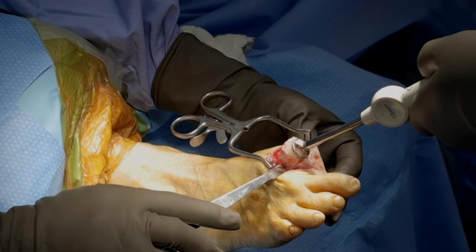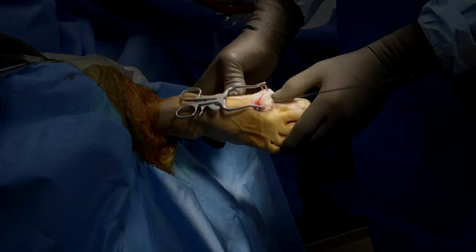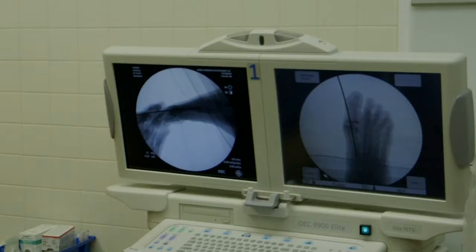You'll see Lori's adjusting me because she's watching from that direction. On a side view I can see that it looks like I'm going down the length of the metatarsal — I might be a little dorsiflexed and we'll check an x-ray. When we bring in the x-ray, especially when you first start doing these, it's a good idea to check x-ray and make sure you're happy with where your wire is sitting in the metatarsal. You can see on that view I'm straight down the metatarsal shaft.